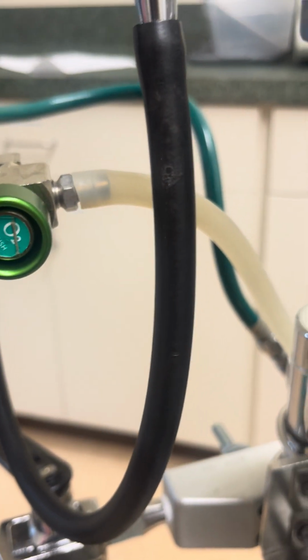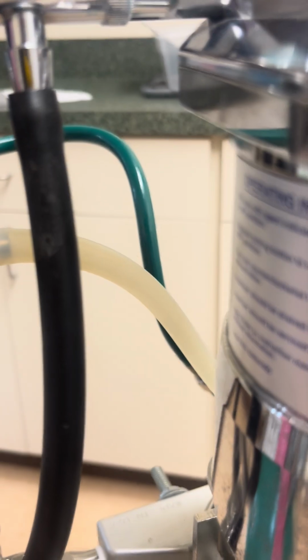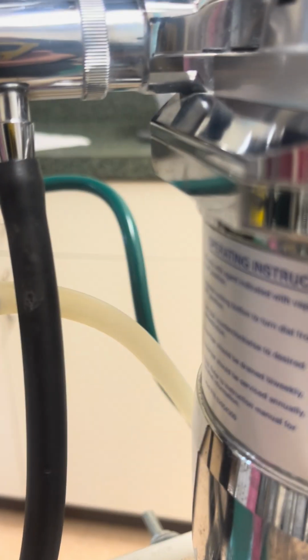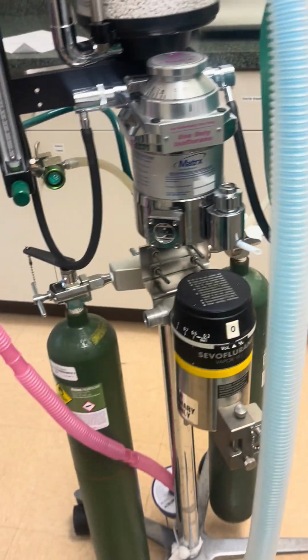And then our last up is our O2 flush. This flush fills the anesthetic machine with 100% pure O2, used to pressure check or bleed the lines of the system, and do not touch while the patient is hooked to the machine. And that is everything of the rebreathing system.